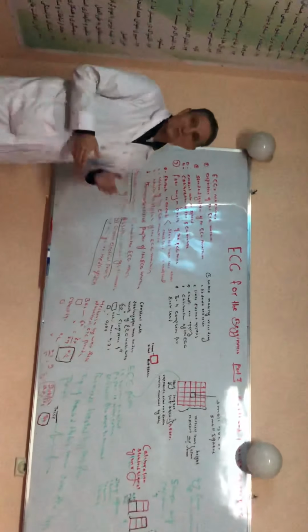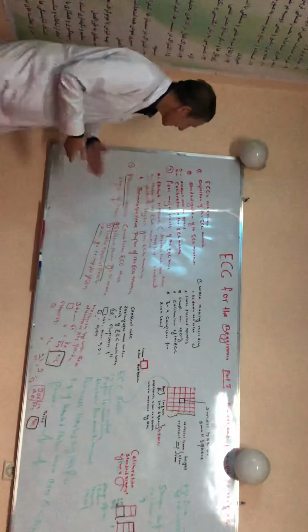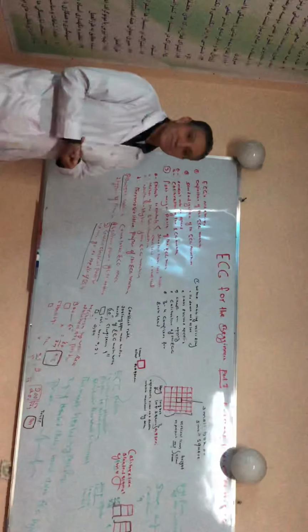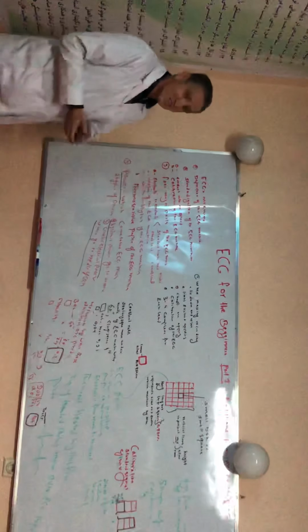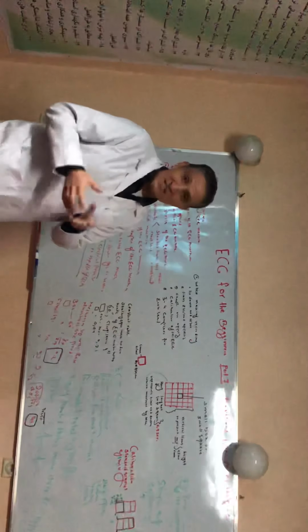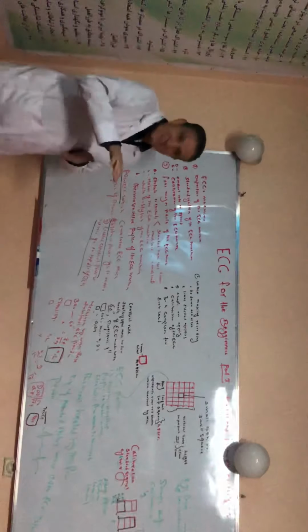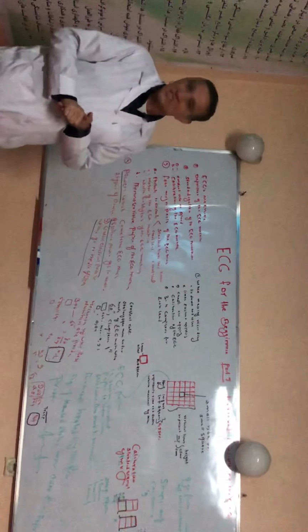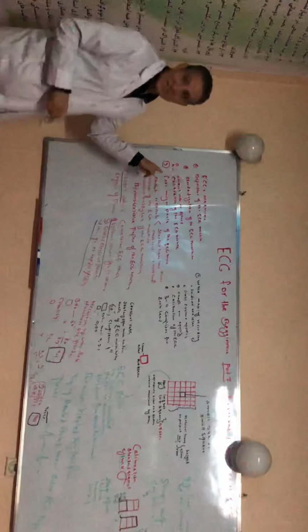Then we will discuss those mechanisms by which these numbers are produced. So standardization of the ECG machine is characterized by two things. Number one is constant rate or constant speed. What does it mean, constant rate? When 300 large squares or large boxes of the ECG paper move under the stylus or needle of the ECG machine within 60 seconds, this represents the constant speed.